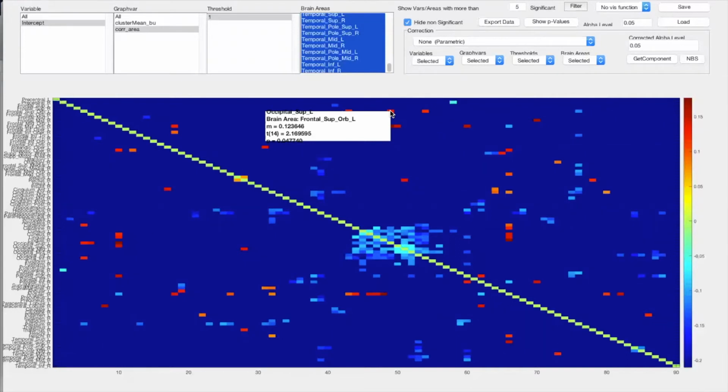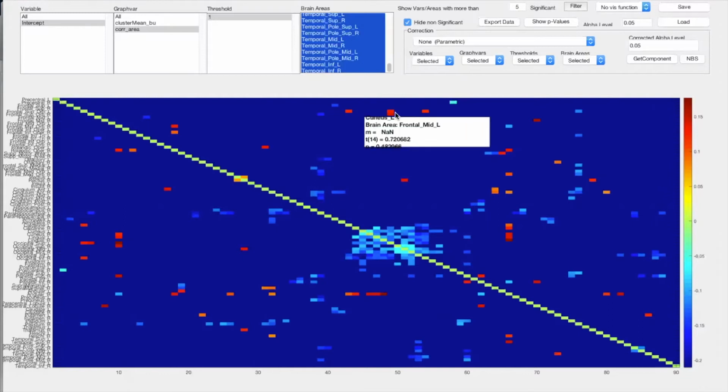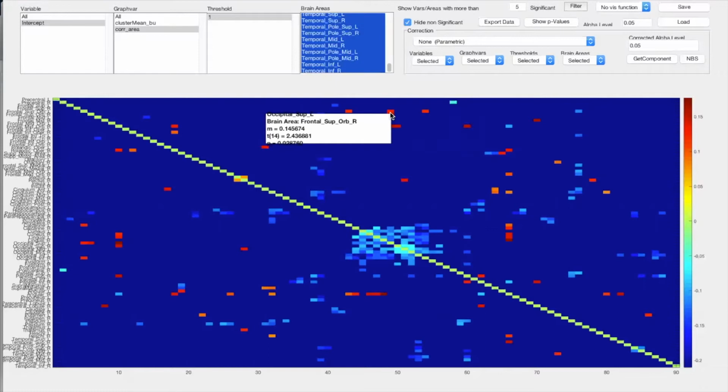And we know that time point 2 is subtracted minus time point 1. Here we have a positive value, the m, the mean value. This means time point 2, the connectivity, because we are looking here now only at connectivity values, not at the clustering, must be bigger at time point 2. So there was an increase in connectivity across time.